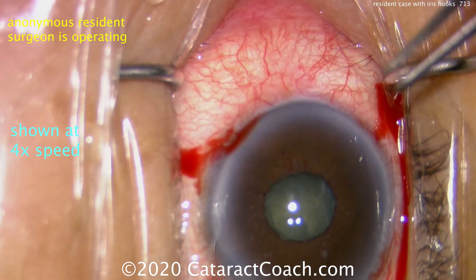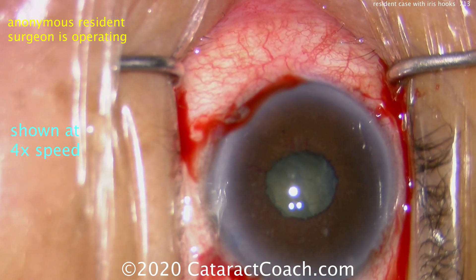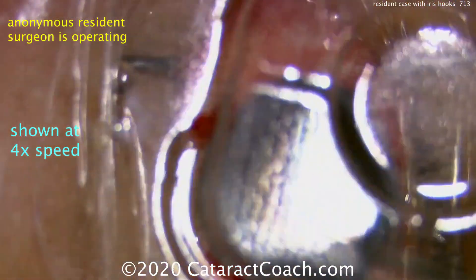Making four paracentesis incisions. You can see these are a little bit smaller than typical, and they're angled downward. You want to angle them the same path that you'd use to place the iris hook — not parallel to the iris plane, but rather angling down.